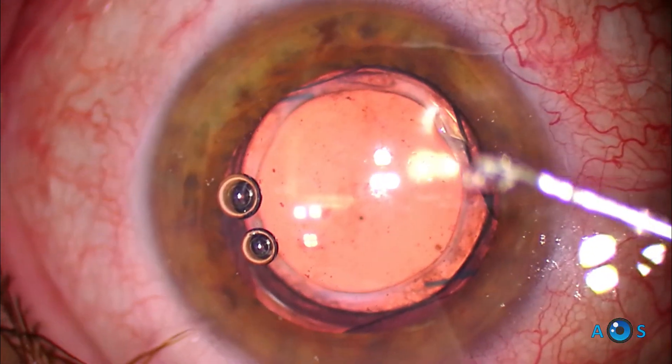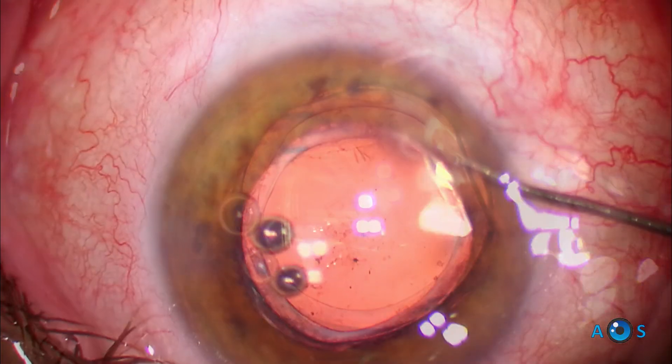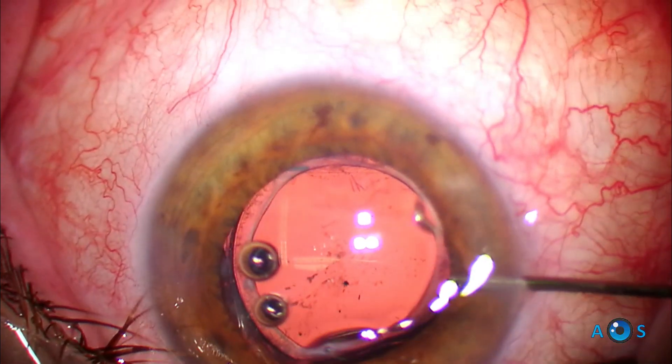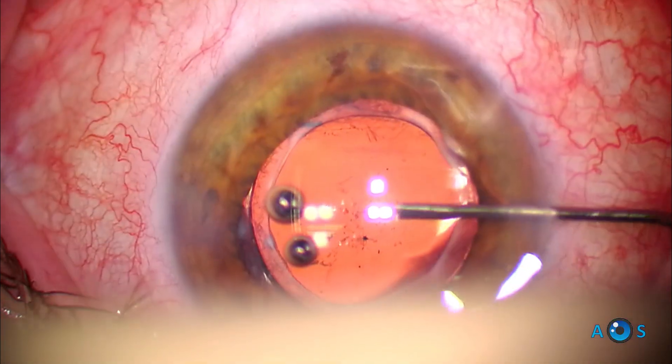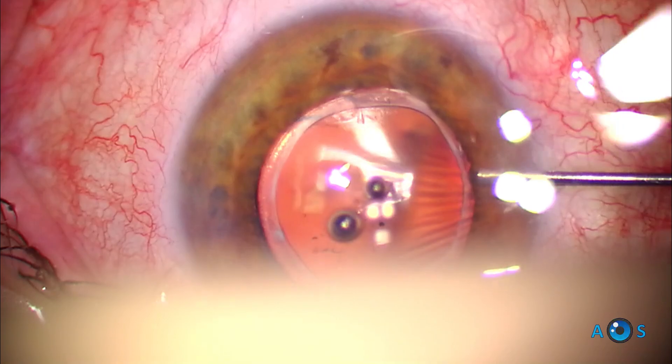The surgeon should check that the lens is stable and centered in order to optimize vision improvement. OVD is then washed out with BSS solution and the corneal incision hydrated. Miochol may be used to further stabilize the lens, but it is not necessary.